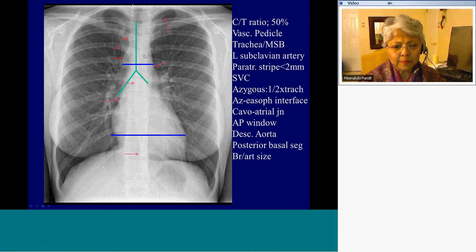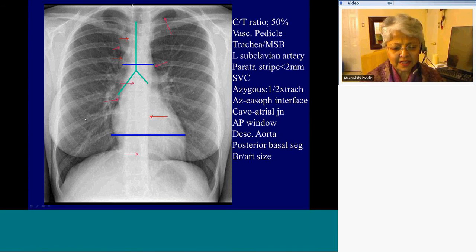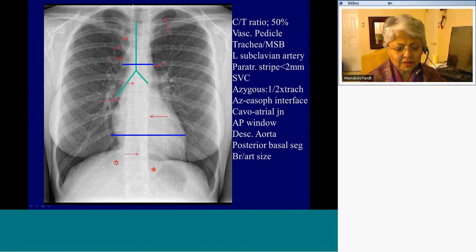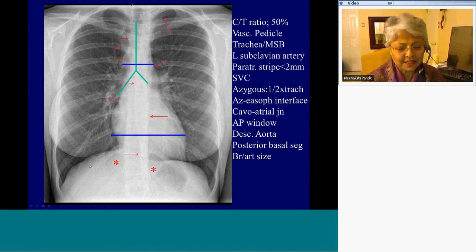This is the AP window — this is the aortic arch, the concavity being the AP window, and below it is the central pulmonary artery. This interface of the descending thoracic aorta causes the contact of the left lower lobe with the descending aorta. The two important locations in the lung to remember are the posterior basal segments of the right and left lobes, seen before the level of the diaphragm — they could be of roughly equal radiodensity.